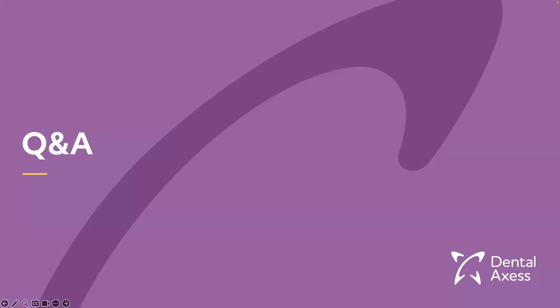Another question here around the number of stages. So what if I don't want as many aligners in my treatment plan, or at least my patients, I think is what they're talking about. That is another good one, because in some cases they just want to reduce the treatment plan, trying to reduce the aligners, which means we are going to make the treatment plan shorter.